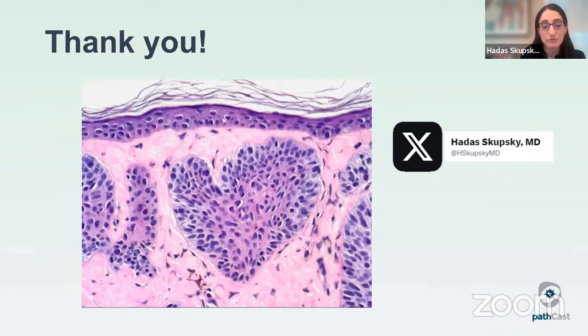So in a verruca, sometimes, first of all, it's hard, right? Verruca was on the differential of papillomatosis, and you always consider it there. Sometimes a very late stage verruca might not have your characteristic findings of a verruca, which are coilocytes, right? So coilocytic change of the granular layer, which is vacuolization of those granular cells due to viral cytopathic change. If you see coilocytes clearly in the context of papillomatosis, you've got your diagnosis of a verruca, but we're not always lucky enough to have them there.